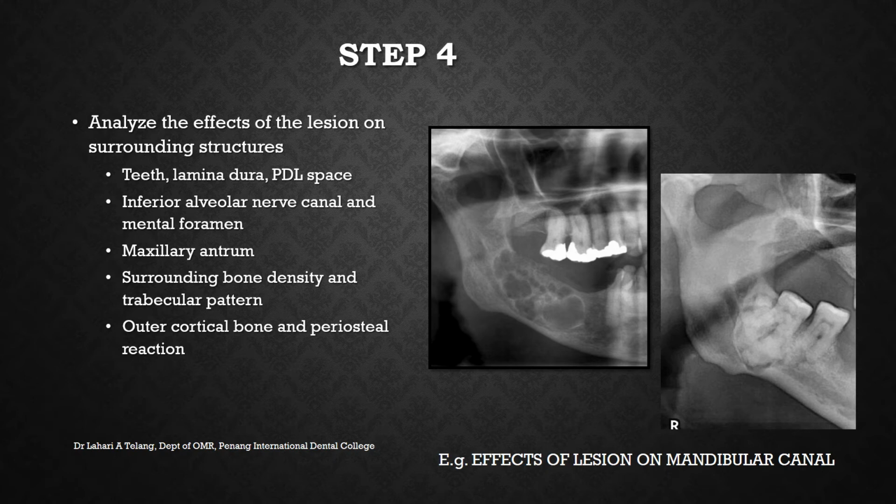An example for this that you've seen here in the pictures would be the effect of the lesion on the mandibular canal here. In both these lesions, you see that the mandibular canal has been involved. The lesion has managed to push the mandibular canal or involve the mandibular canal.